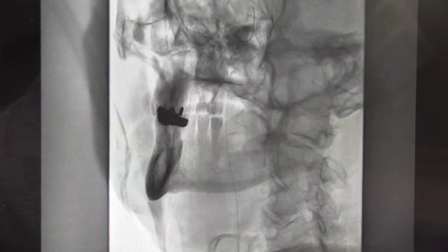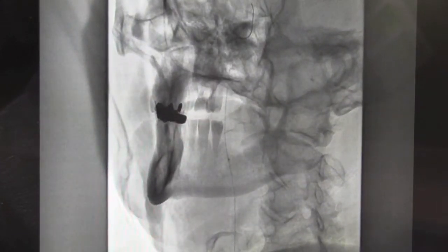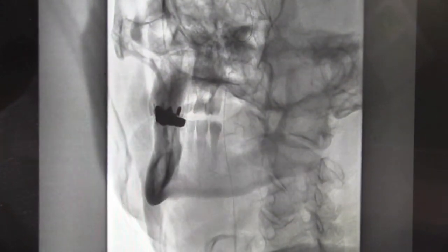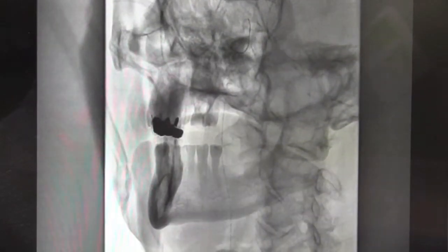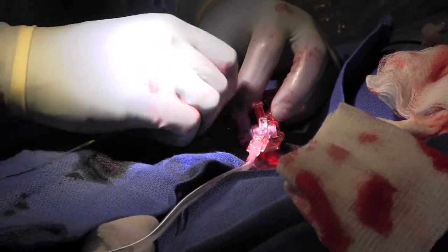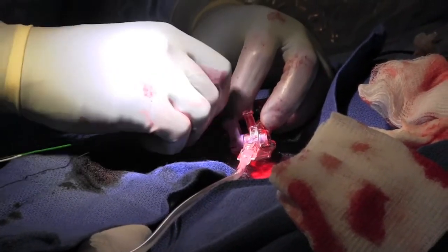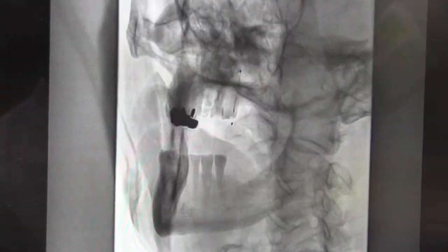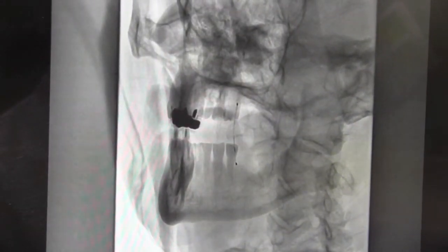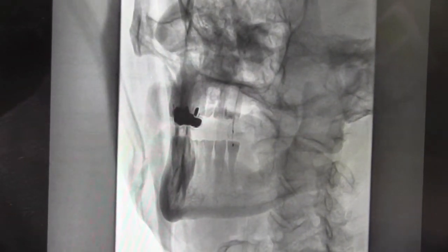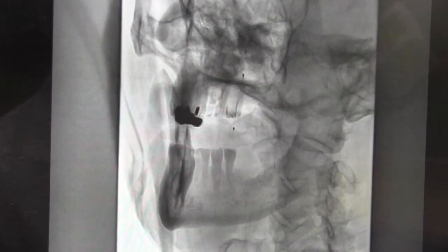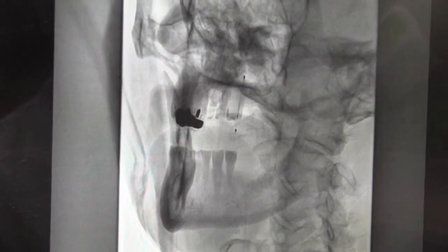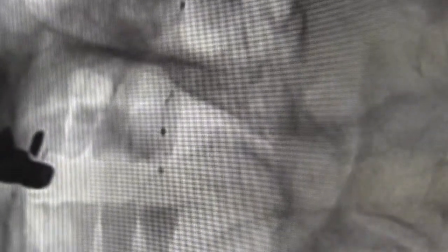Here we're advancing a spider distal embolic protection device delivery catheter over our wire. This device is a small filter that will capture any plaque debris that might break off from the carotid artery when we're fixing it with the balloon and stent. Here we're releasing the spider distal embolic protection device.